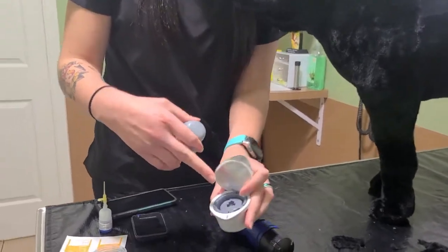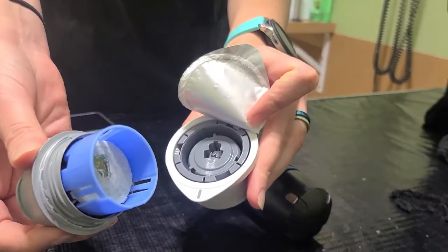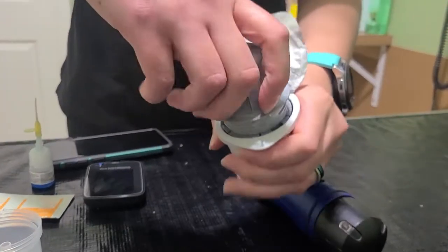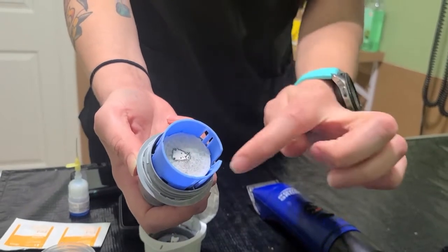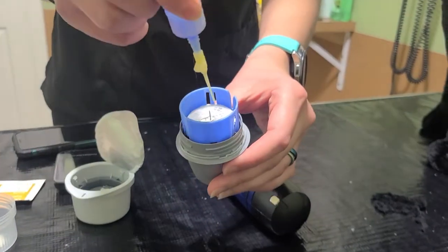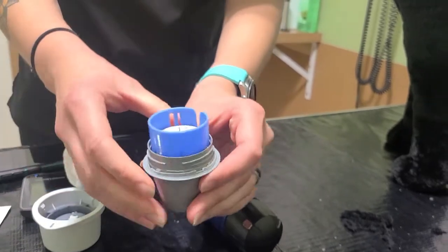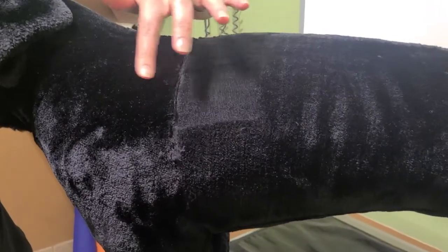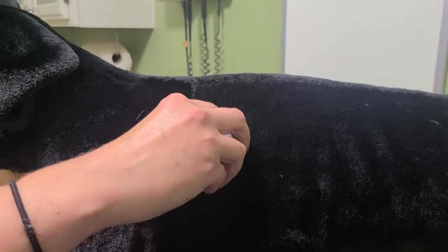This is your sensor needle in here. It is in a sterile pack that you open. This is going to be the adhesive part that you're going to punch onto the needle. Now you can see the needle and this is the adhesive part, the white area. You're going to take some type of suture glue and apply it on the adhesive part and let it sit for about a couple of seconds. Then after you alcohol this area to make sure it is clean and free of oils, you're going to apply, press down, and let go.